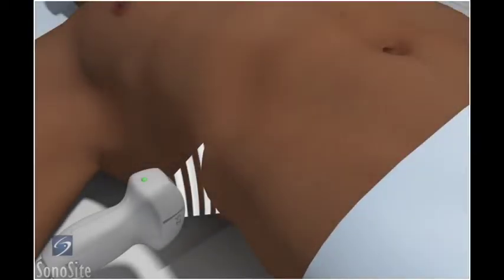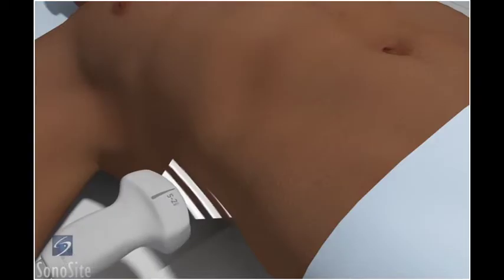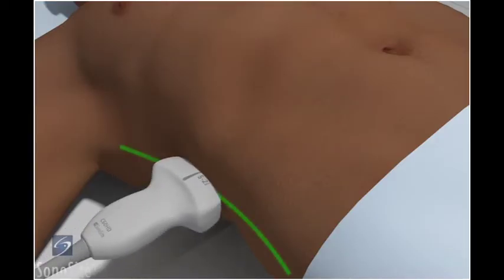The transducer is placed in a long-axis orientation along the right mid-axillary line at the costal margin, with the orientation marker directed toward the patient's head. If it is difficult to visualize the kidney, a deep inspiration will move the kidney below the ribs for easier access.